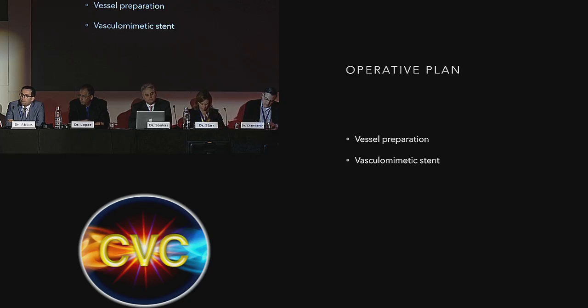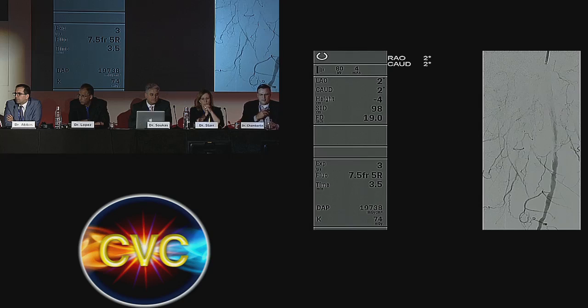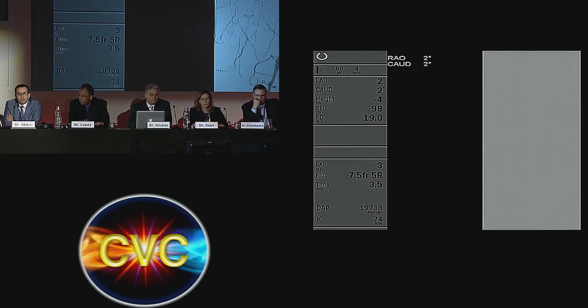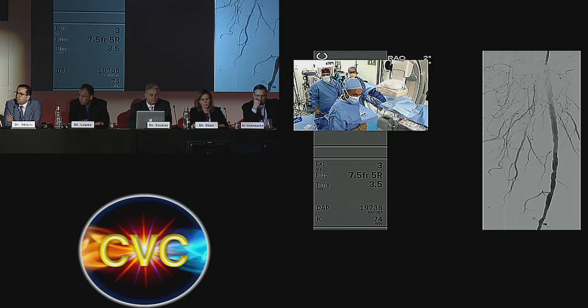So let's go with the first image on our angio. Chris, thank you. So as you see, this is just a fairly straightforward antegrade stick. You see how that's fairly diseased from the proximal, mid and distal SFA, more pronounced into that distal SFA. That's where they found that 3 to 4 meters per second lesion. Go next.